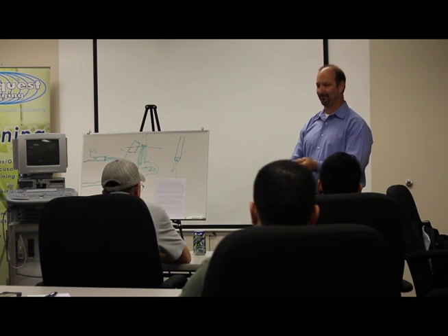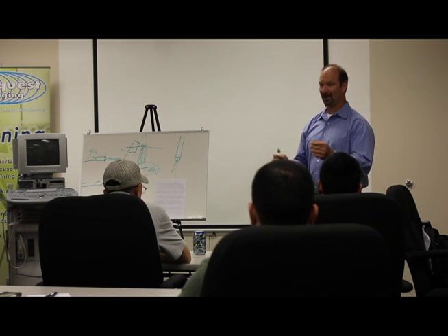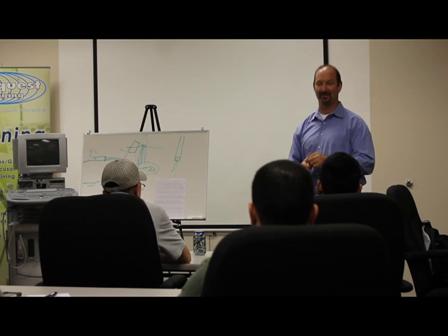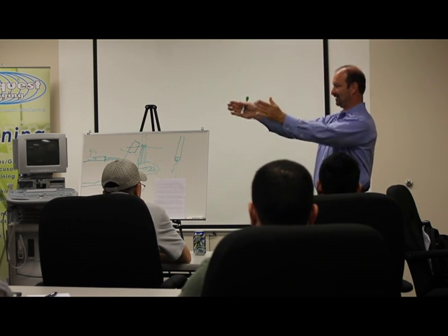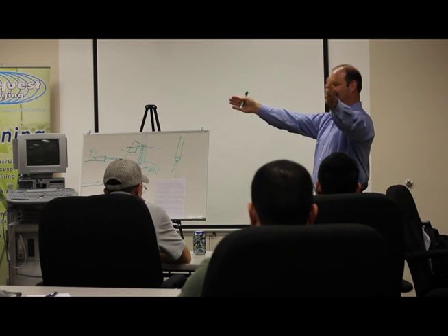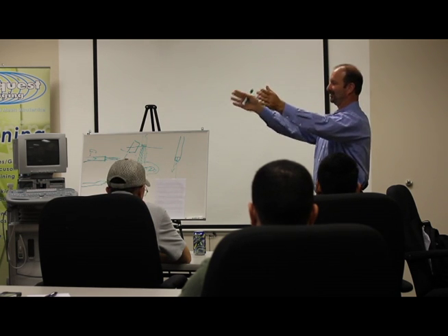There was actually a guy, Dr. Doppler, sounds funny, but that was his name. And he's the one that invented this equation. It's got to be under 60 degrees, that's 90 degrees. So it's got to be under 60 degrees.